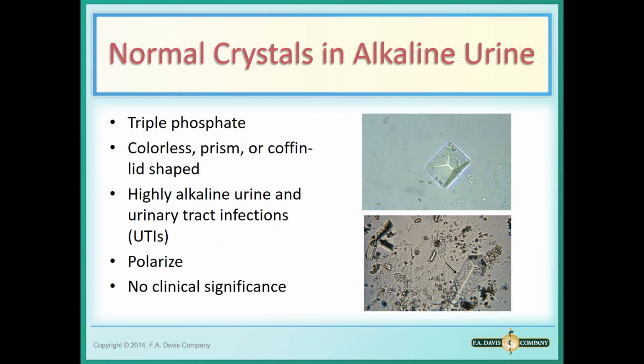And I would strongly suggest that you make a list, or on that illustration that I gave you, note: is it an acid pH? Is it an alkaline pH? Is it a normal pH? Does it not matter what pH? I would strongly recommend that you identify which ones are alkaline and which ones are acid.